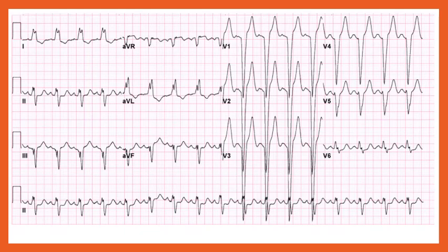And so my two questions remain the same, and that is, is the patient in sinus rhythm, number one? And number two, is there a bundle branch block pattern visible to you? And if so, what kind of bundle branch block does this patient have? Take a moment and look this over.